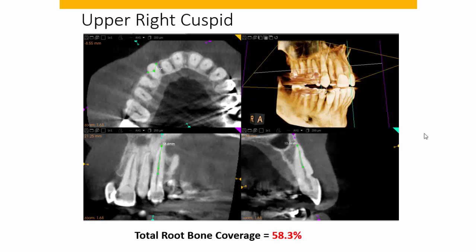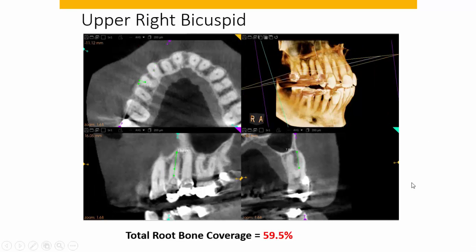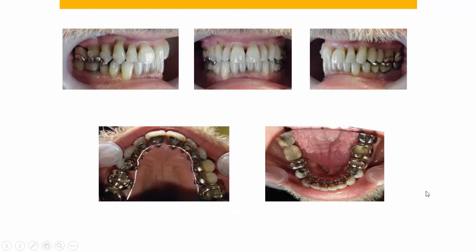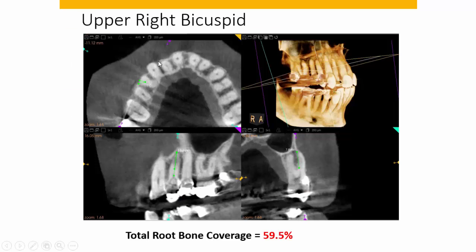On the lower we did a fairly aggressive interproximal reduction scheme. The upper cuspid and upper first bicuspid were both about 59% total root bone coverage. A few months before debanding, treated with lingual appliances, I want you to look at the bony defect associated with the upper right cuspid. The question is whether there's room to properly retract this cuspid into the class one position without causing further damage to the cortical plate and supporting bone — you can't put a square peg in a round hole.